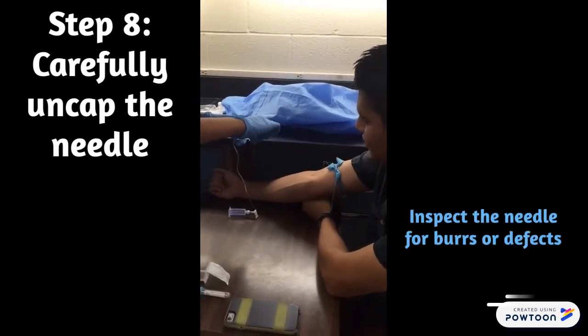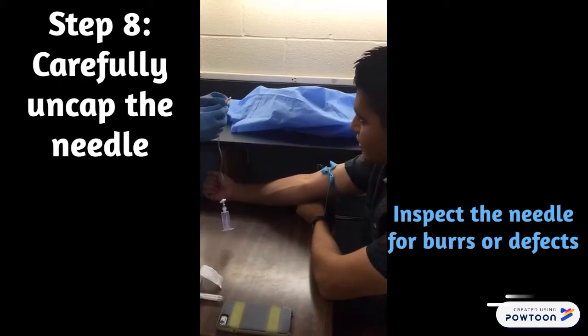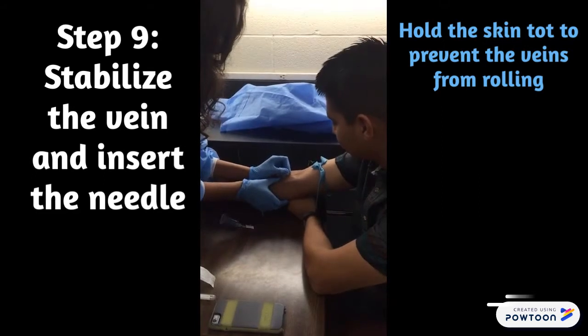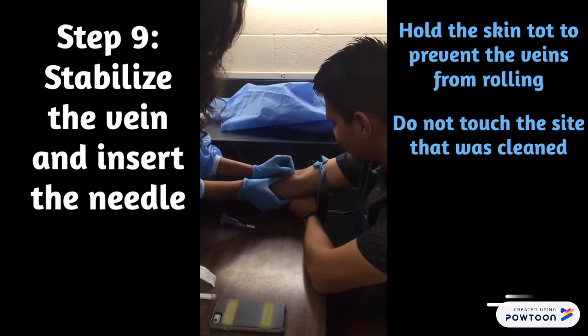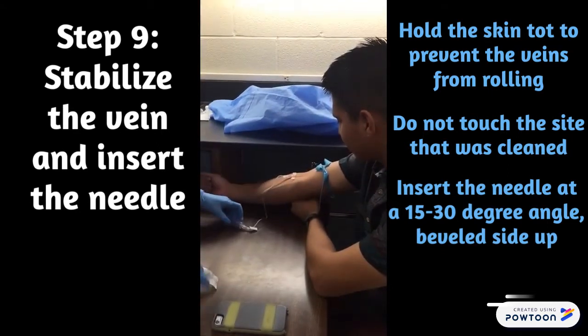The next step is to inspect the needle for any flaws or burrs that could hurt the patient. Anchor the vein by holding the skin near the puncture site taut, and insert the needle at a 15 to 30 degree angle with the bevel side facing up.